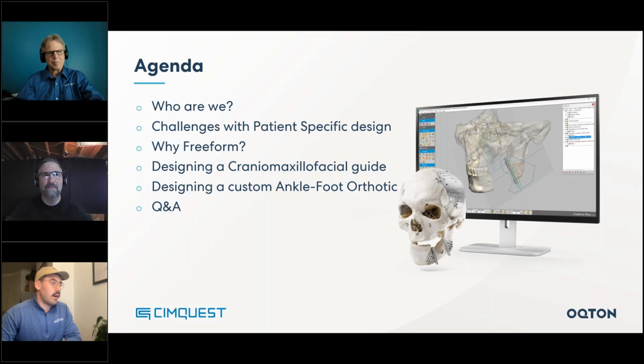So a short agenda before I pass over to the presenters today. Both Joel and Dave are going to give a bit of an intro to themselves, who they are, why you should be listening. We're then going to jump right in and discuss why you're all here. We're going to look at some of the challenges associated with patient-specific instrumentation and patient-specific design, how Freeform addresses these challenges, and then we will jump into the software and take a look at two example workflows.